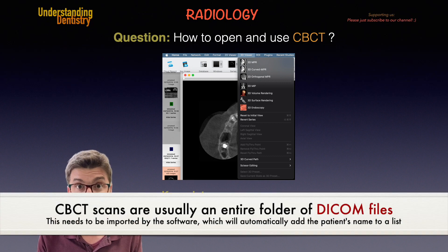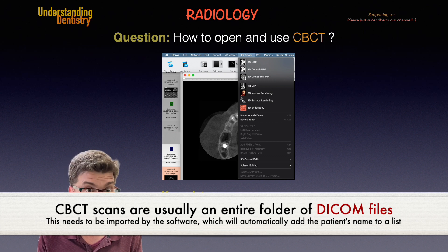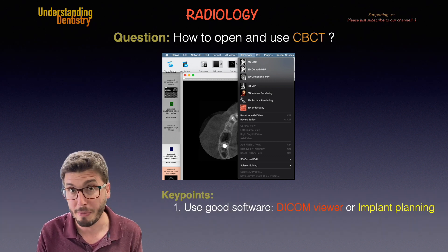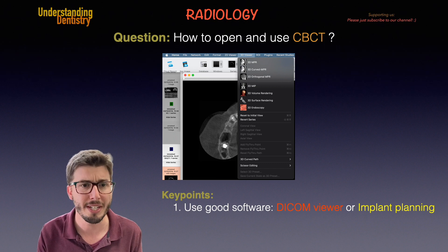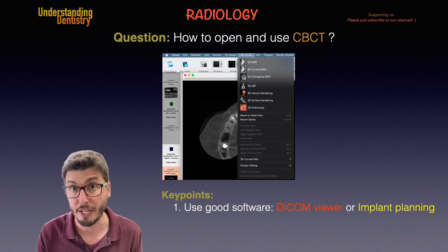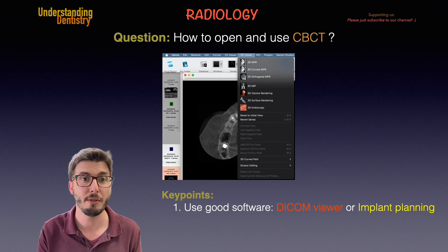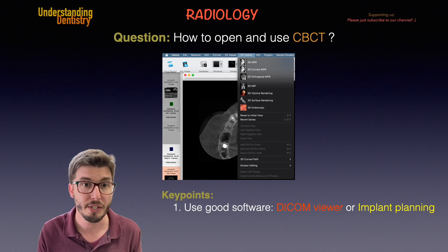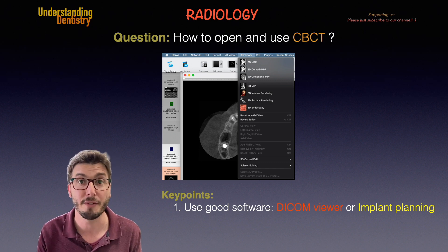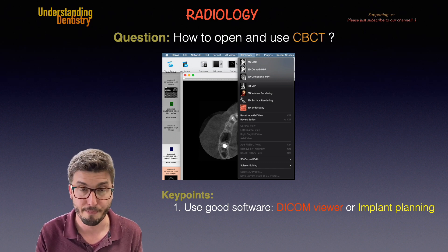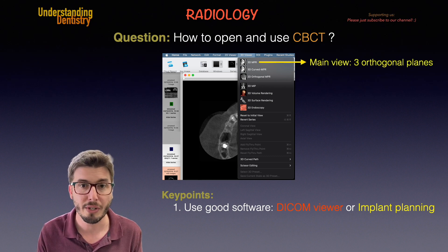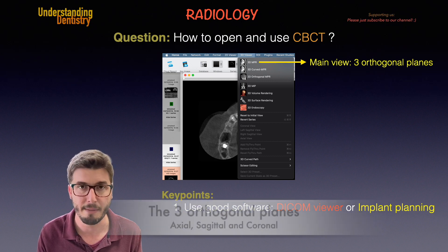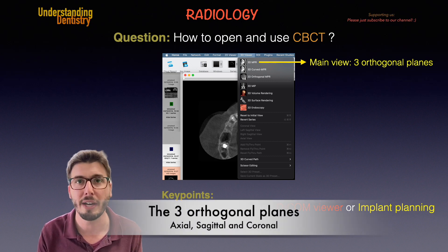Here we are seeing the interface of one of these viewers, and pretty much almost all of them have a similar interface. The first thing that they open is the axial slices — we are seeing the axial slices of a CBCT. Looking at the menu, the first option is the 3D MPR, which stands for multiplanar reconstruction. This is the main view for us to see the three orthogonal planes at the same time: the axial, sagittal, and coronal planes.